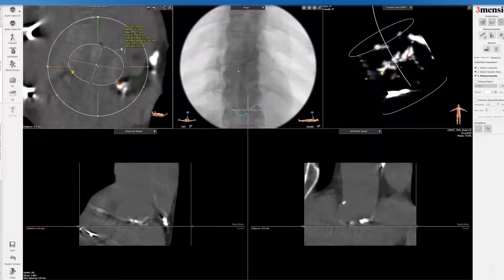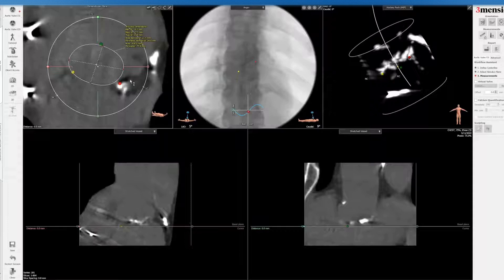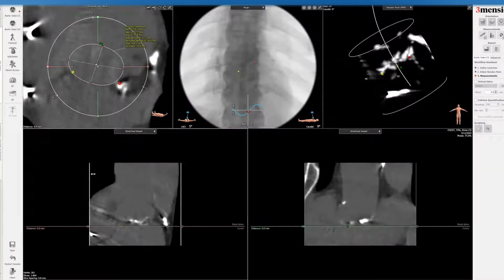With a non-contrast scan, if you are not sure about the sizing, I would err on the side of caution — perhaps undersize with a balloon-expandable valve, or true-size rather than oversize, because there's a rupture risk if you're oversized. Self-expanding valves are typically more forgiving in terms of aortic root injury. So as long as the coronary obstruction risk is low, I would in this case perhaps use a self-expanding valve rather than a balloon-expandable valve, unless there's a compelling reason to do otherwise.